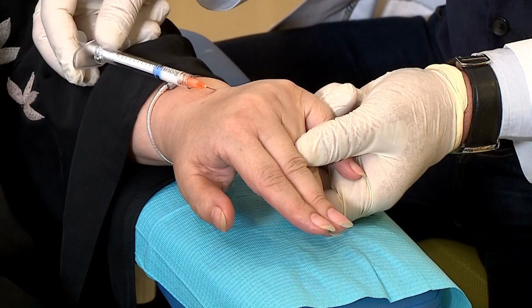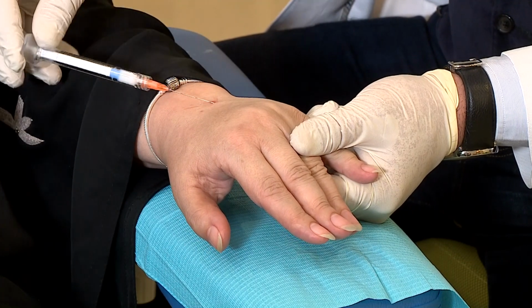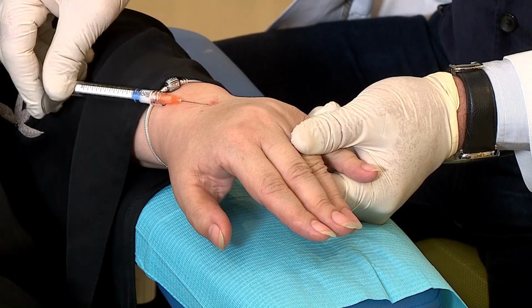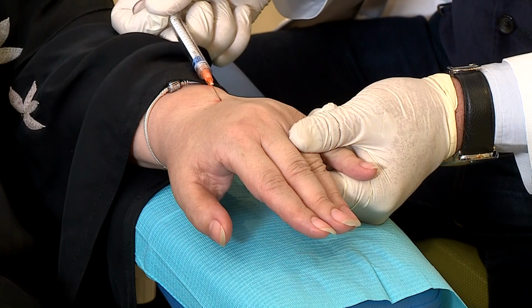You can look at the tip of the cannula, at the plane here, injecting, and also on the side. So this is convenient, less pain, and just an easy procedure to do.